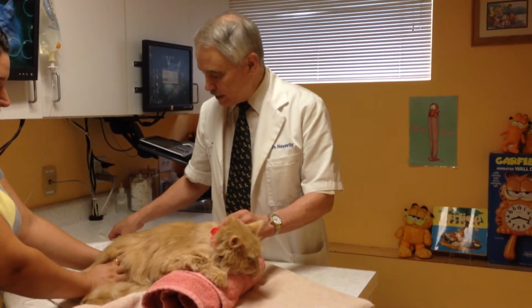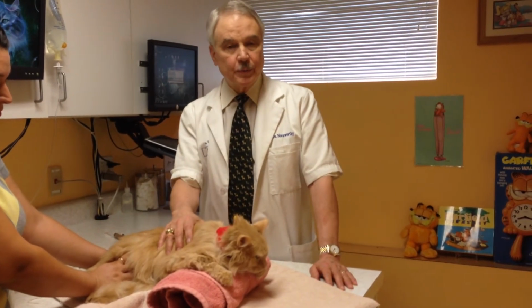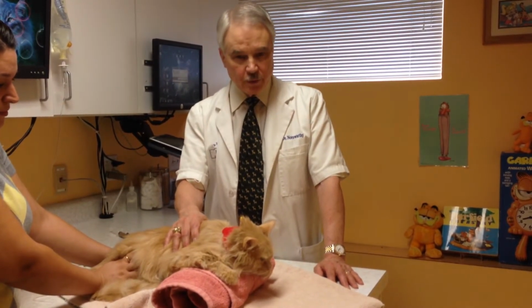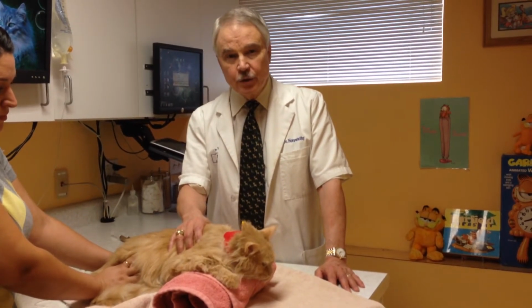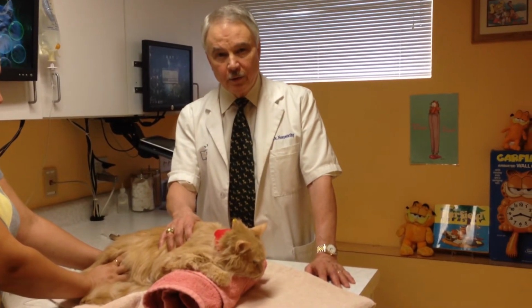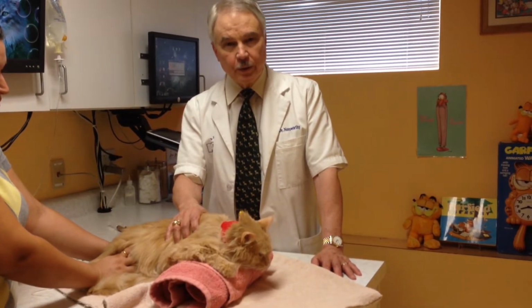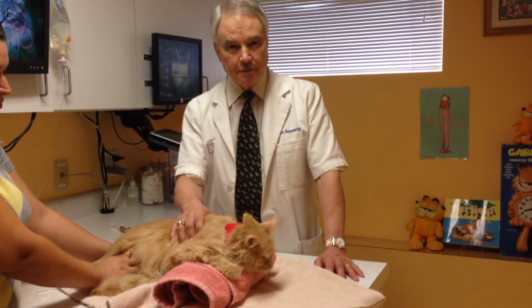We have a written set of instructions, and in this instruction it starts by telling you that we have a special food for this purpose. This food is very high in calories, it's very high in protein, it's very nutritious for the cat. It doesn't have a very good taste, so we don't recommend that you try to feed your cat this food out of a bowl or with a syringe, but it works extremely well for feeding tubes. The instructions tell you to put 2 cans of maximum calorie into a blender with about an ounce of water and blend it so that it's nice and smooth.